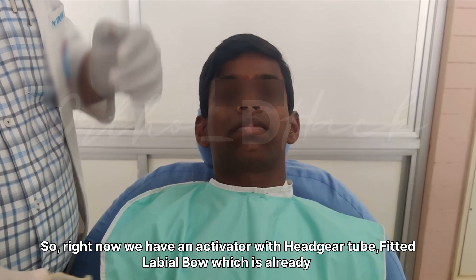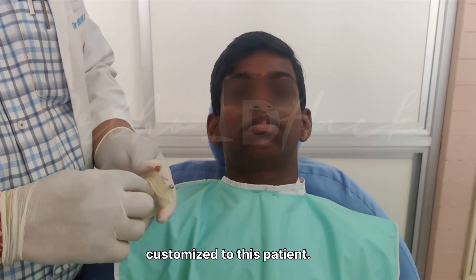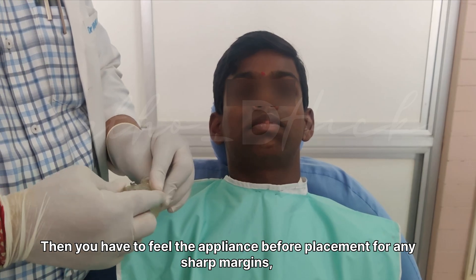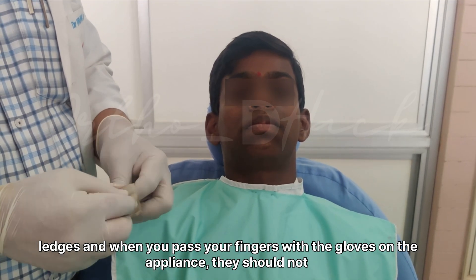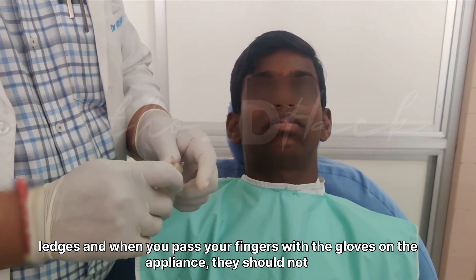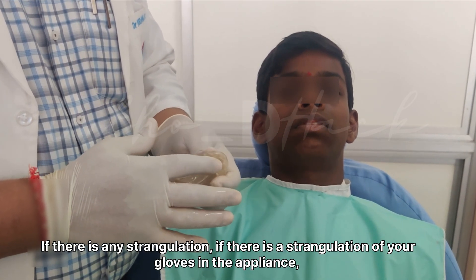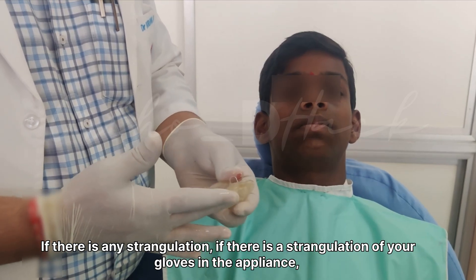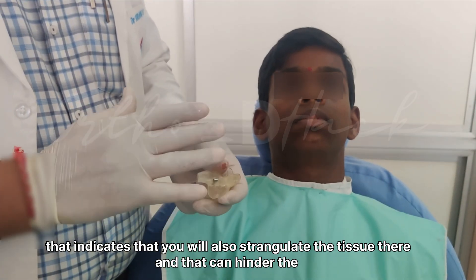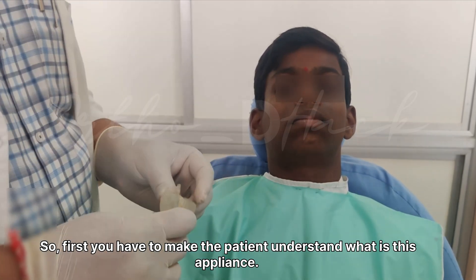We have an activator with headgear tube, fitted labial bow already customized to this patient. You have to feel the appliance before placement for any sharp margins. When you pass your gloved fingers over the appliance, there should not be any strangulation of the gloves. If there is strangulation of the gloves, that indicates the appliance will also strangulate the tissue, which can hinder the patient's cooperation.